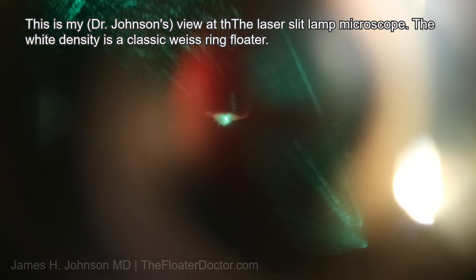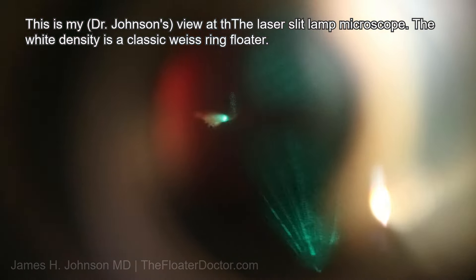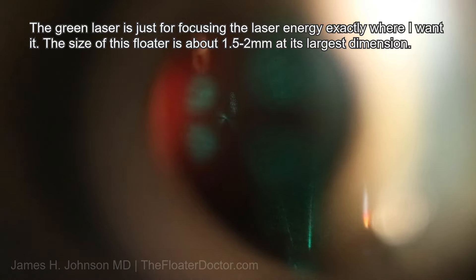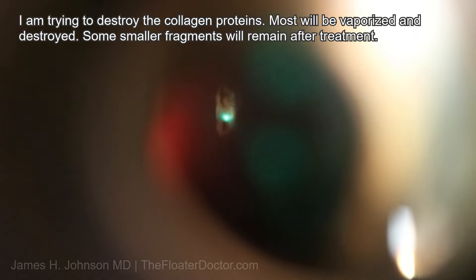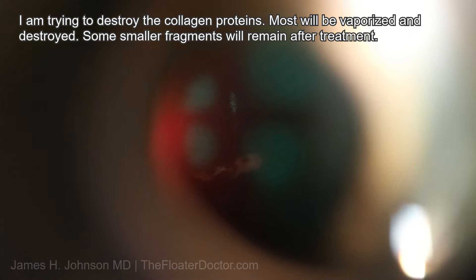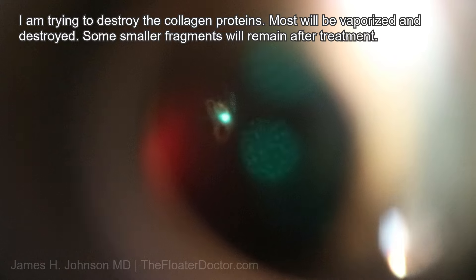What I've got is my focusing beams — this laser has the green focusing beams. Those are the two things we'll see kind of dancing around on the front surface. The first one goes something like that — you see it dance. Oh, there's the ring, there's a hole. And then you see the bubbles coming off that.